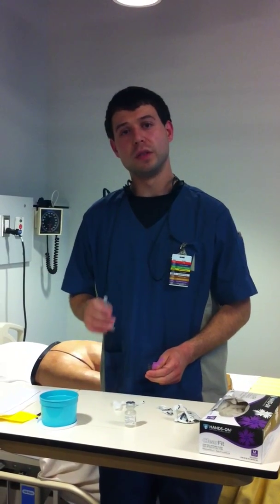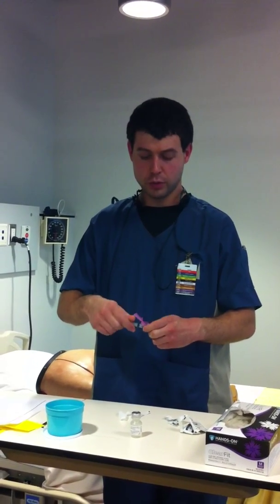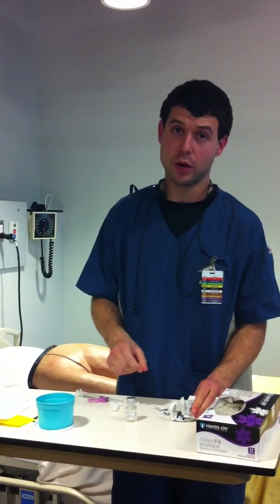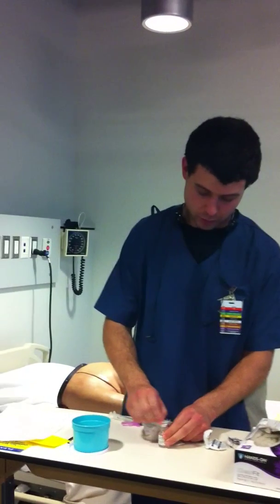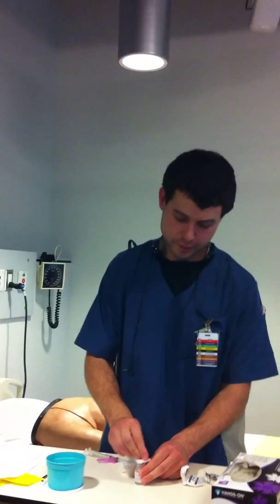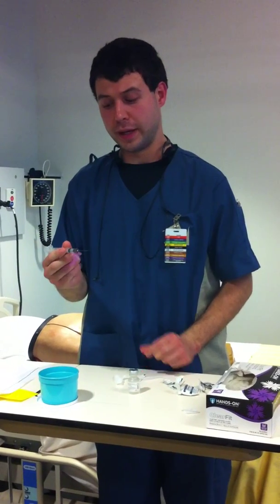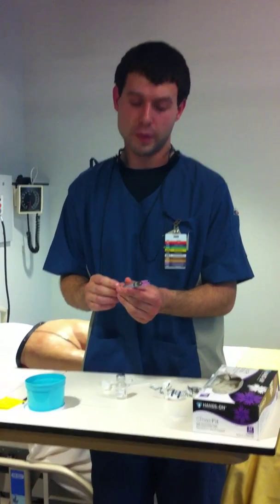For this, since we are administering to the ventral gluteal site, we're going to need a 3 milliliter syringe and a 1.5 inch needle. So, screw the needle on. Okay. Next, I am going to wipe the top of the vial with an alcohol swab to prevent any contamination. And I'm going to do that in a circular motion. Okay. Now I'm going to aspirate 0.5 milliliters of air into the vial, and this will make it easier for me to withdraw the medication.